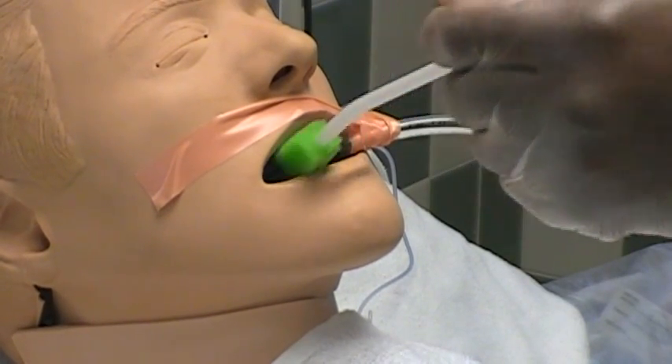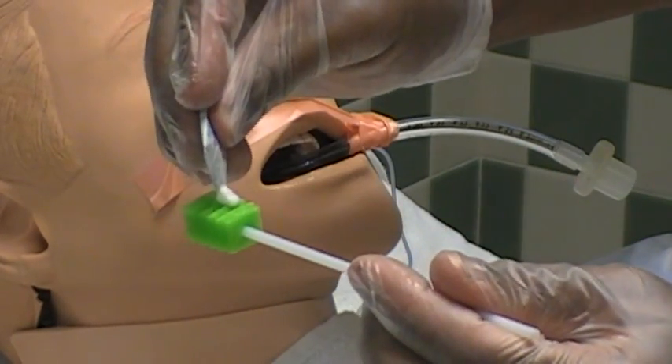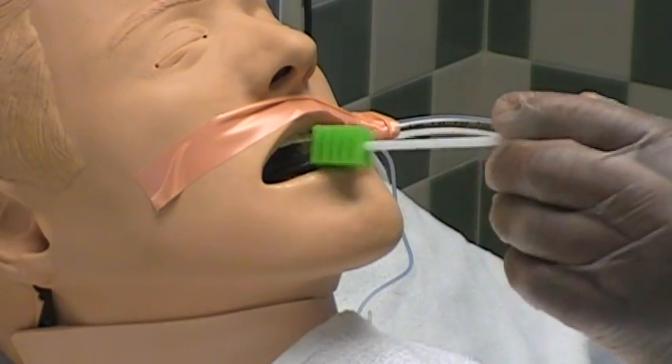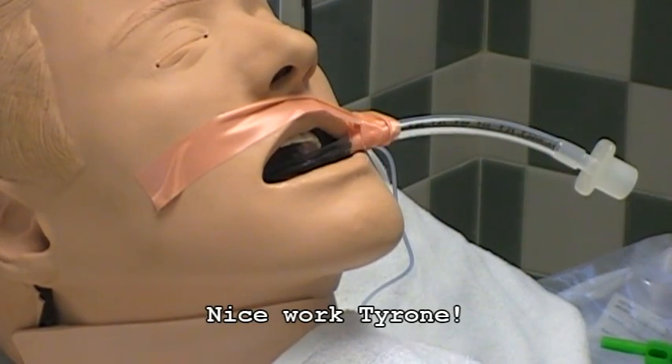When he's done with that, he's going to place a little of the mouth moisturizer on the patient's mouth and a little lip balm on the patient's lips if needed. Once he gets that all applied, he's just going to make sure the patient is comfortable, and then he is done with mouth care.